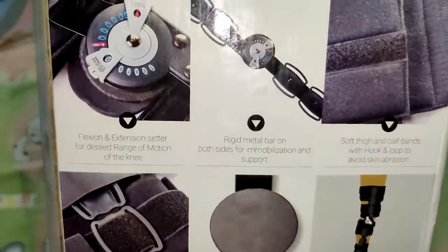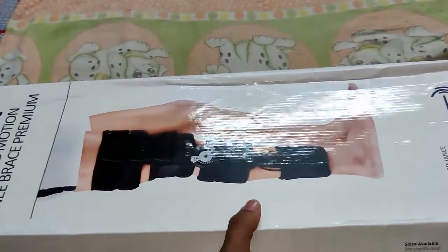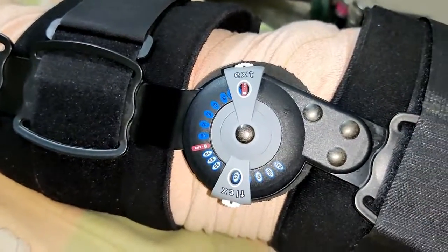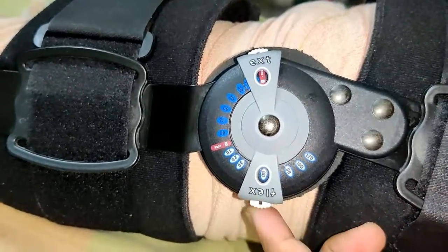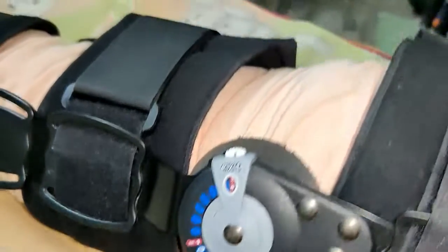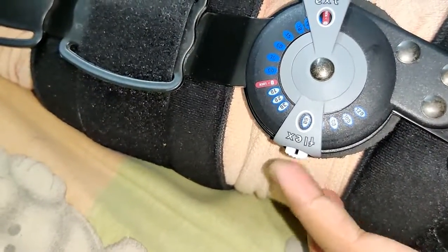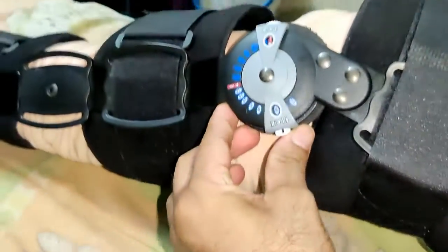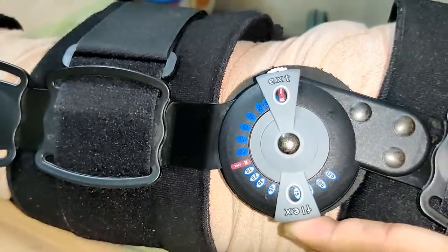The product looks like this on the outside. After fixing the product, this is how it looks. We have a flexion option here — these degrees can be adjusted according to your case. Currently I'm at 60 degrees. Once the second dressing crepe bandage has been removed, this needs to be adjusted to 90 degrees by pressing this button, so you can bend the knee up to 90 degrees like this.